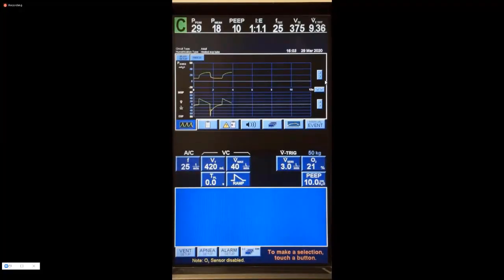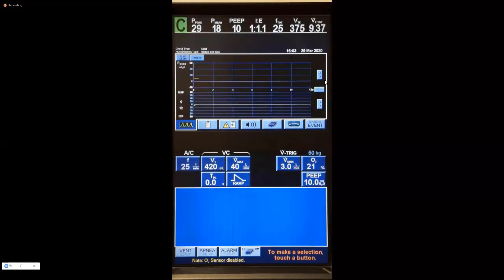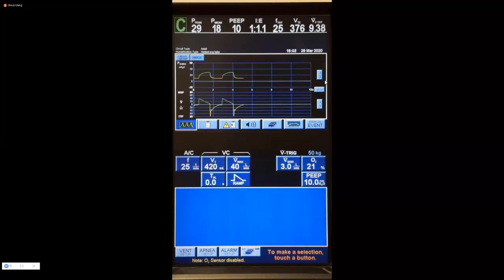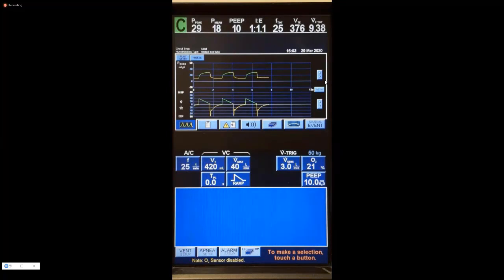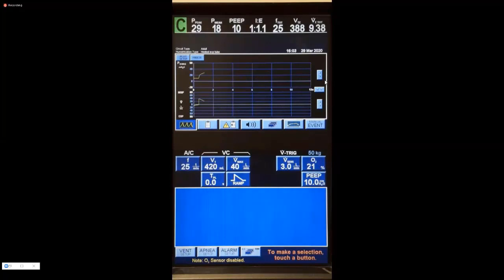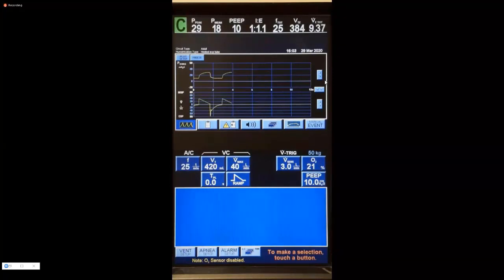Once again, we're looking at the vent screen here. So the patient is sedated and paralyzed and receiving all controlled breaths. The rate is set at 25 to try to normalize the CO2. And our peak pressures are within an acceptable range for this particular disease state and the severity of it. Since this is right after the initial proning, you won't really see an immediate change in peak pressures from an improvement in compliance. And you will actually most likely see a drop in saturations with a slow increase over time just from the actual physical proning of the patient.